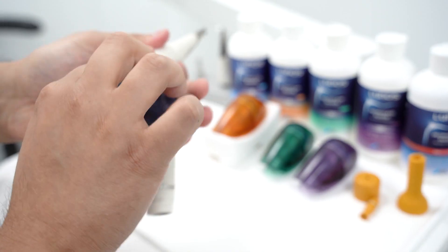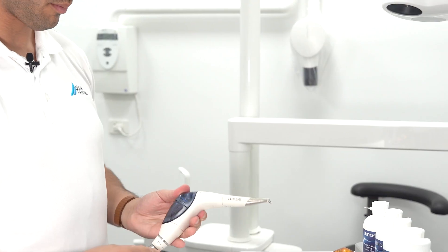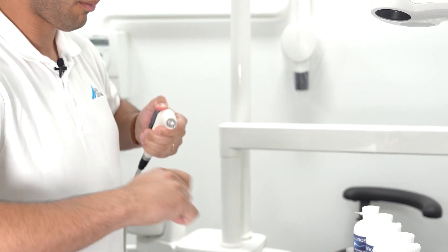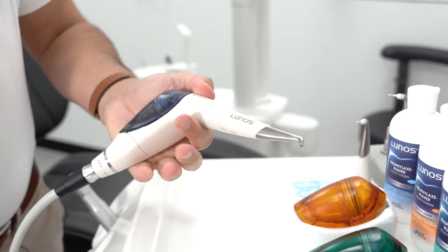while ensuring minimal strain on the wrist. The nozzles are also quickly and easily replaceable. The Mylinos Supra nozzle is suitable for all supragingival prophylaxis treatments.